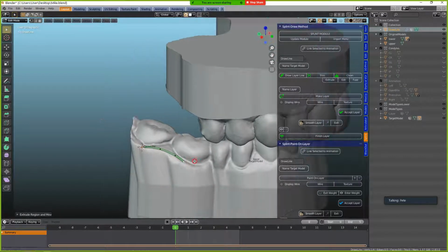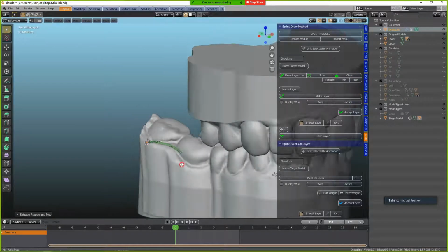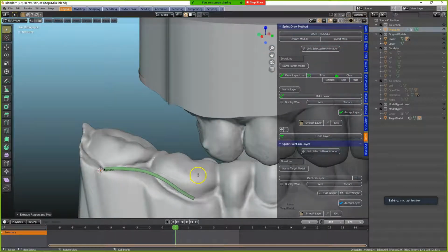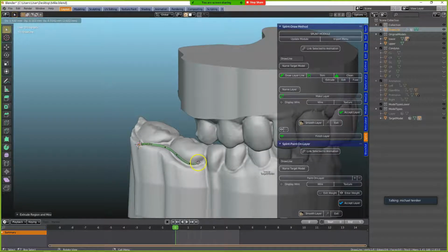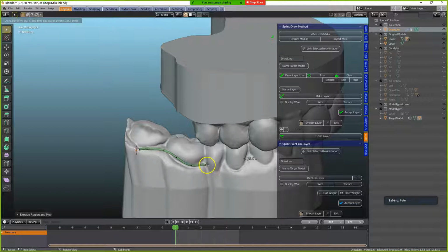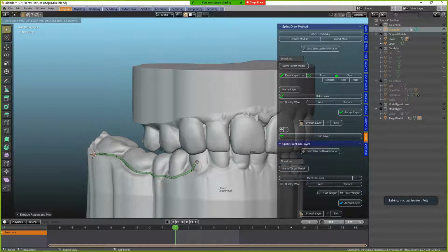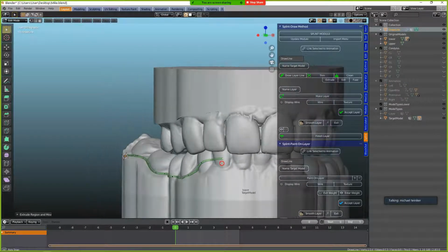Yeah, so when you put it on the teeth, you always have to know more or less where the undercuts are, because we want this to engage. If we put it up halfway, it'll be loose in the patient's mouth, right? So we don't want that. I would recommend we get as much retention as we can, and then we can always go up here if you want to. Yeah. So let's just take this up here.